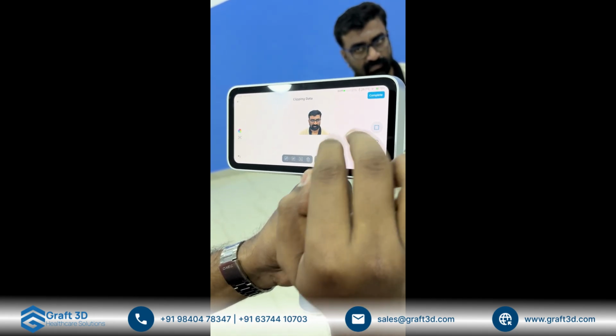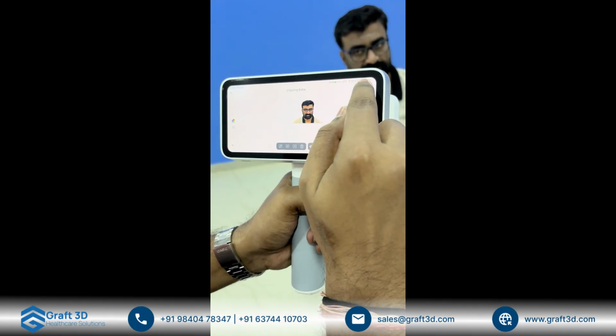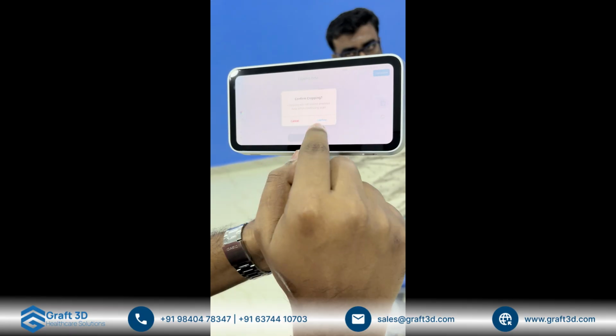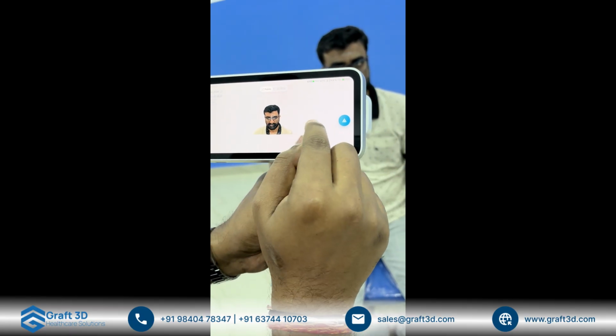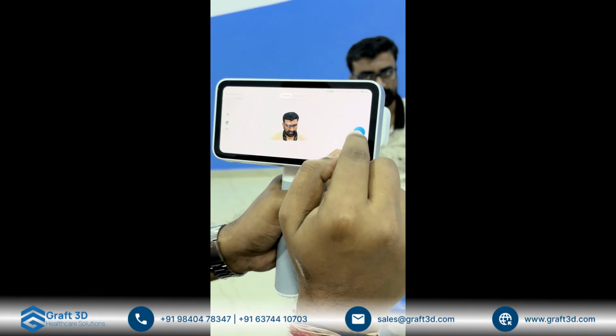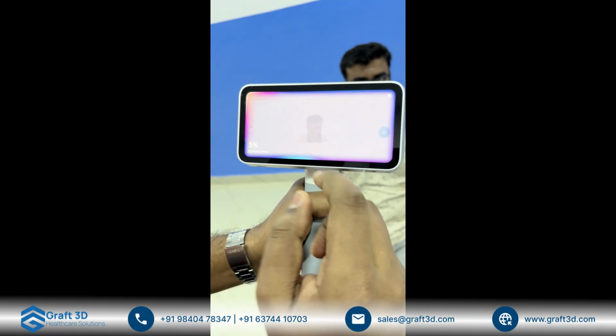Once this is done, this is processing the point cloud data. Once this is done, we'll click on complete. It says confirm cropping. We can click on confirm. Okay. So now once this is done, we'll click on the mesh optimization. It will take some amount of time to generate the mesh from it.